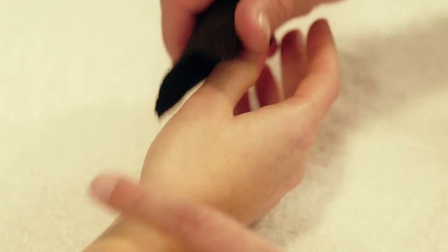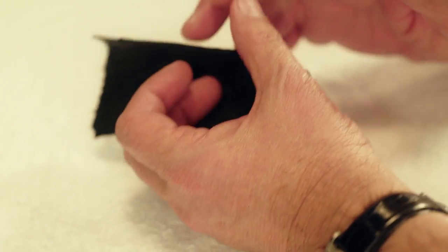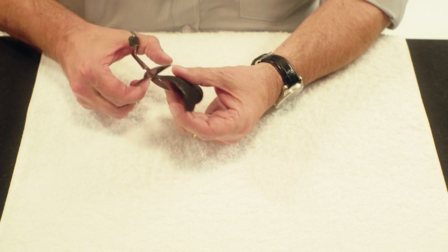Once the Orphicast has hardened, remove the orthosis. Trim the edges and round all corners on the proximal part of the orthosis.